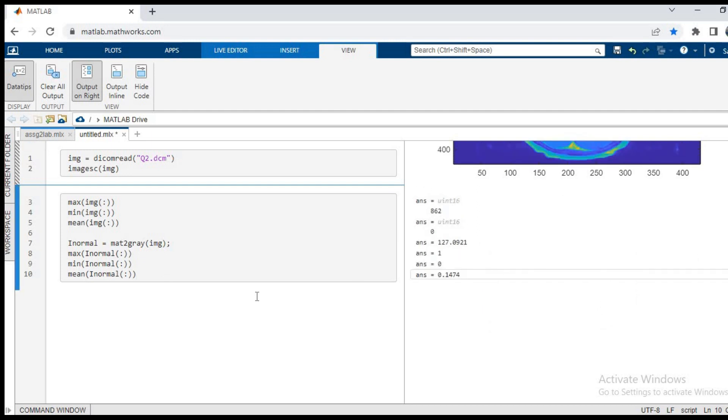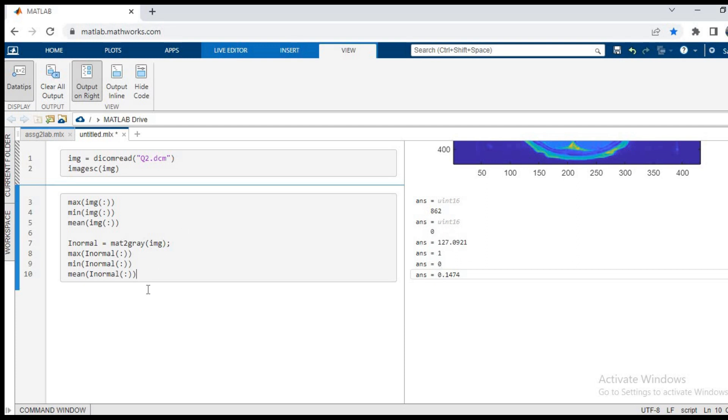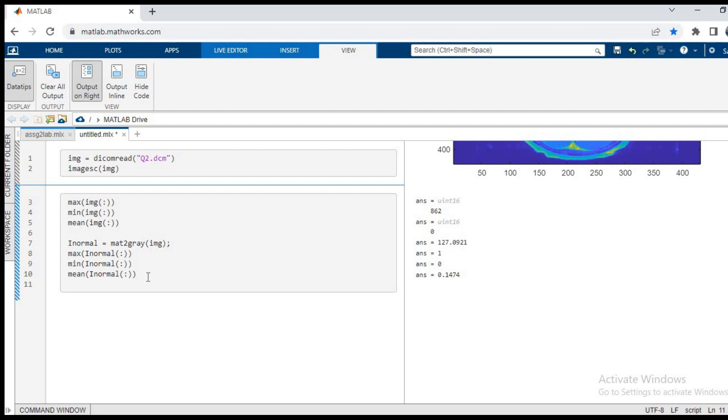As you can see the output, the highest value, the max value in the new image is one, min value being zero, and the mean is 0.14. So as you can see, the max value in my previous image was 862, so that has been reduced to one, and the min value was zero, it now remains the same. So the scaling has been done and my image has been normalized.